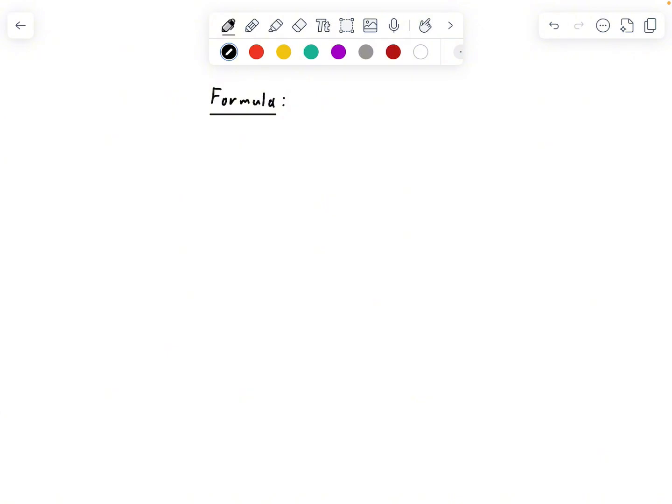So first, let's go ahead and write out the formula for the uncuffed ET tube. So there you have it. There is your uncuffed ET tube formula, age in years, divided by 4 plus 4. Now, another important thing here is that I'll show you the difference between the two different ET tube sizing formulas, but this is going to be the most important one, and I'll explain why in a second. Now, let's go ahead and get into the cuffed ET tube sizing.